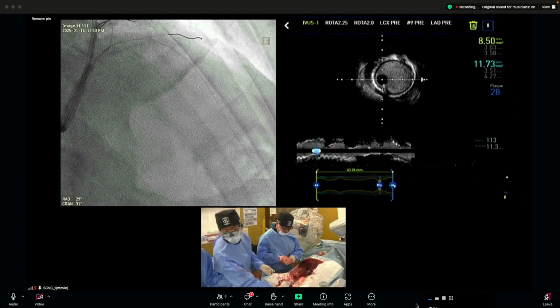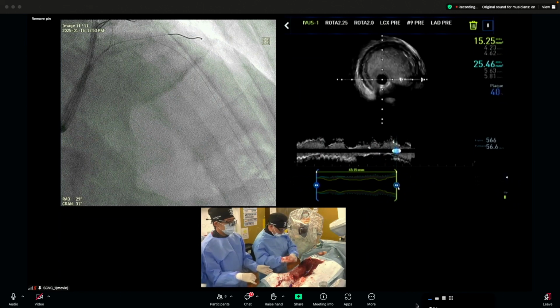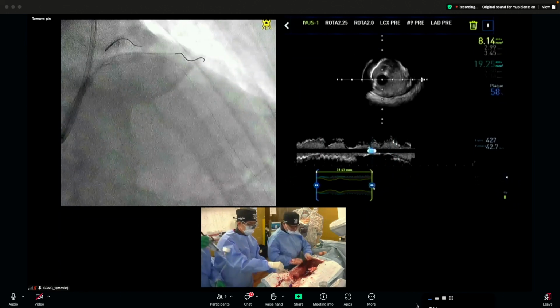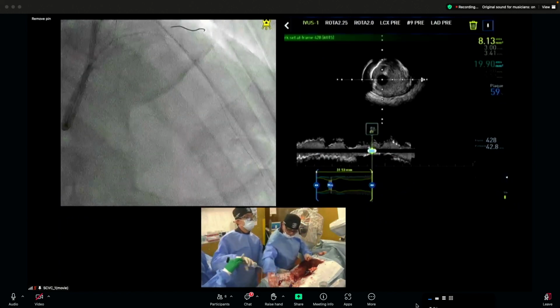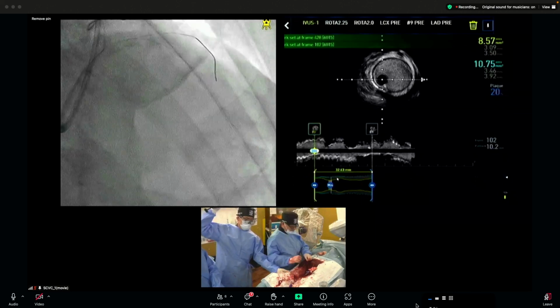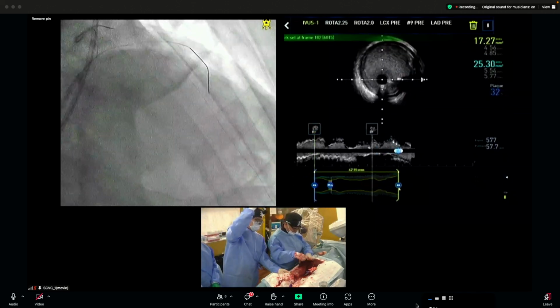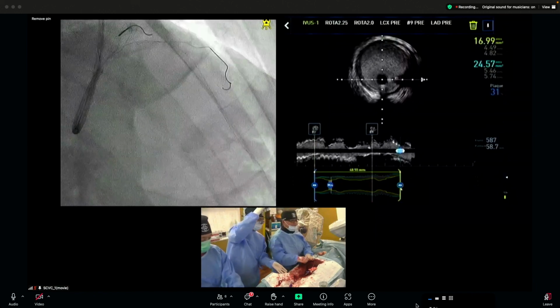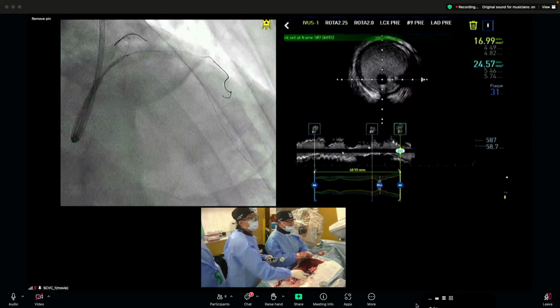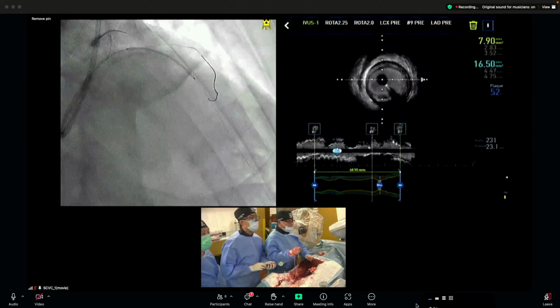And I'd like to mention that in studies comparing eccentric and concentric calcification, the result was less favorable for eccentric calcification. For concentric, we have a lot of techniques, high pressure ballooning, cutting ballooning. For eccentric, it is very difficult to get a circular, well expanded stent result afterwards. So this is a very aggressive preparation. I really would like to see it.